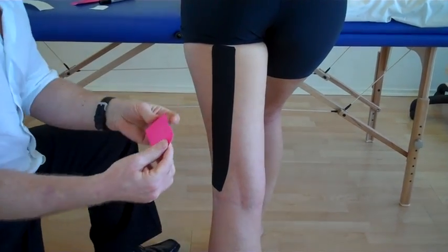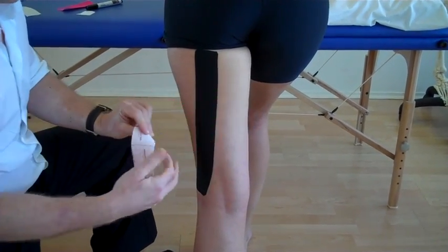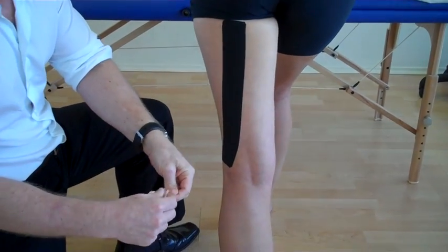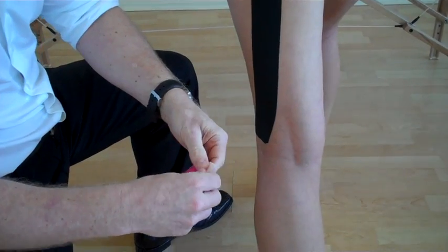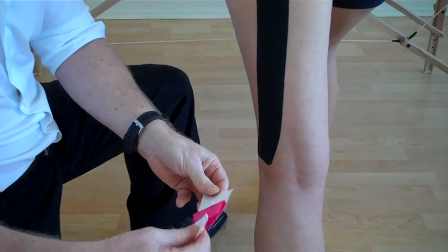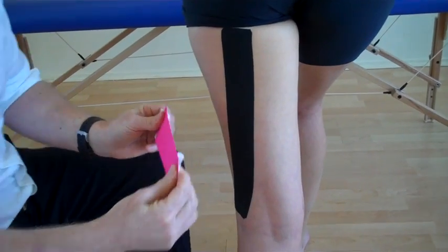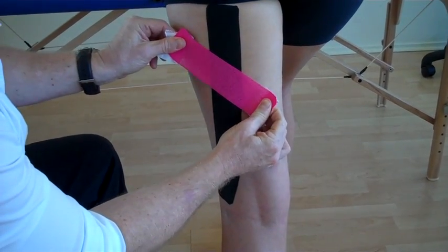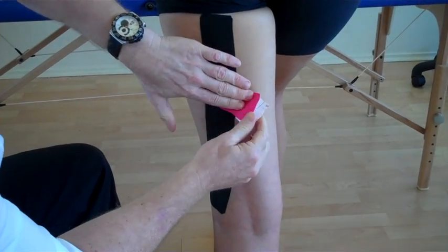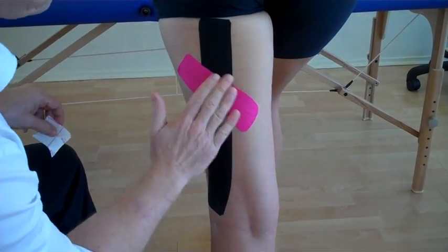You can use two smaller eye strips to make an X over the area of pain. In the middle of the tape, split the tape, peel it back, and lock onto it. Peel back and turn it over — so we've got 100% stretch. Where the pain is located, come across the area of pain. The last bit, no stretch, feed out on both ends. Warm it up.